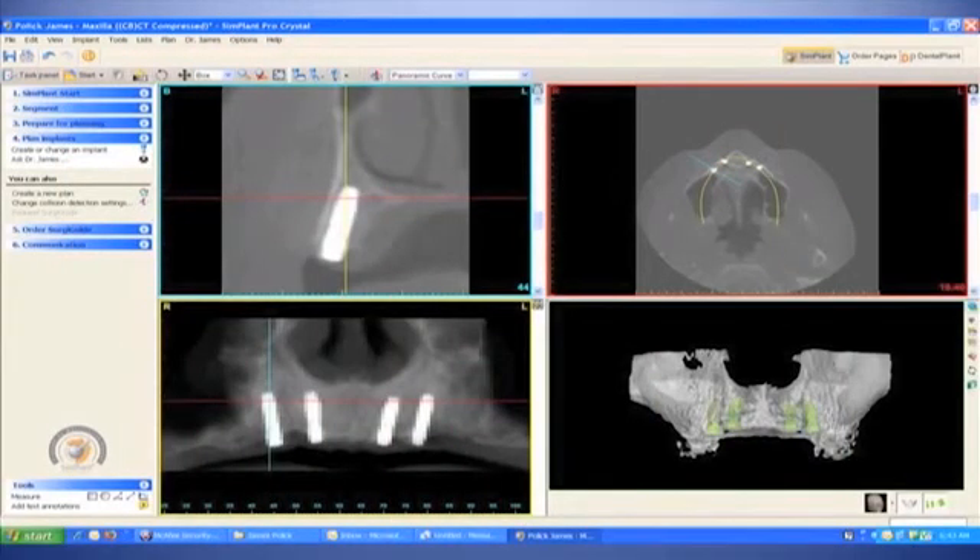Figure 31 illustrates the post-operative CT scan, showing that the implants are in an ideal position and it mimics precisely the virtual placement done prior to any surgical intervention. Here we illustrated the step-by-step process once we do a CT, and I hope this helps in your future treatment planning and surgical and prosthetic use of dental implants.